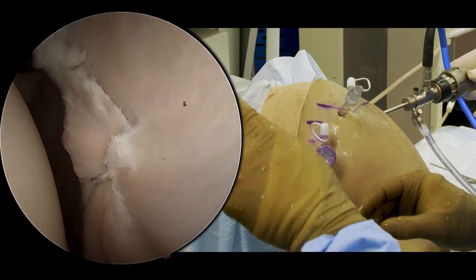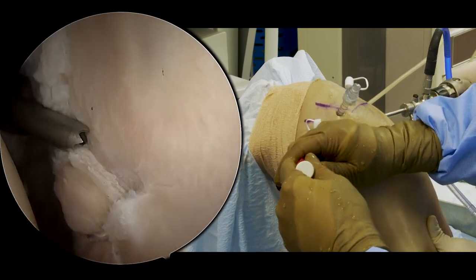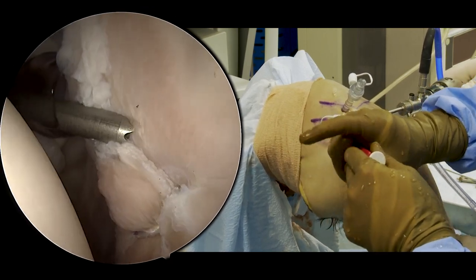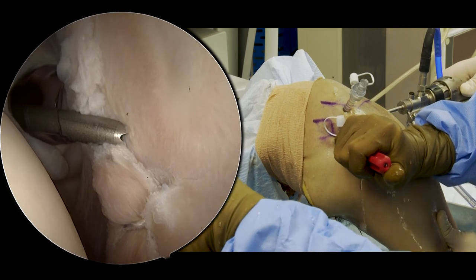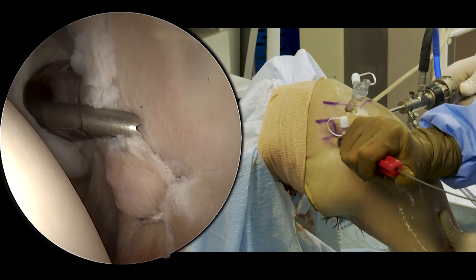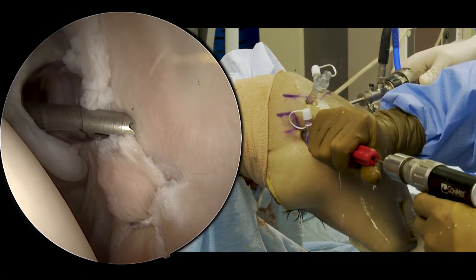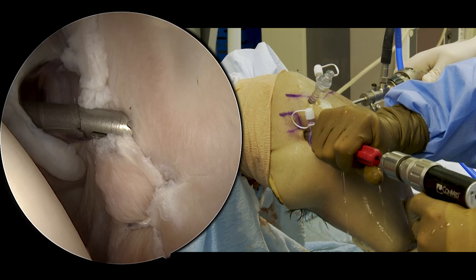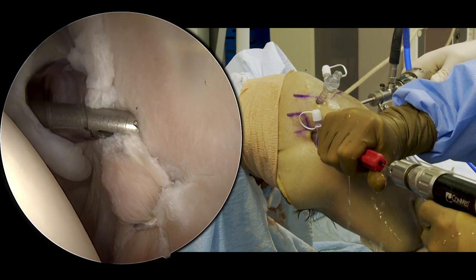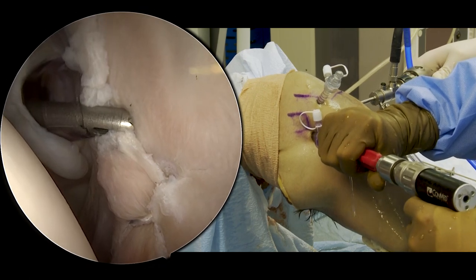Let's put another one in. We'll work our way from inferior to superior. With this anchor, you can also leave them long and then tension at the end if you like. I like to cut them just so that there's less risk of tangling, but you can do it either way. Here we're going to come in with our curved guide up on the face of the glenoid. This drill is not fluted, so if you go in and out a few times it helps to clear the bone out of the tunnel — out of the socket, the drill hole, that you're creating.